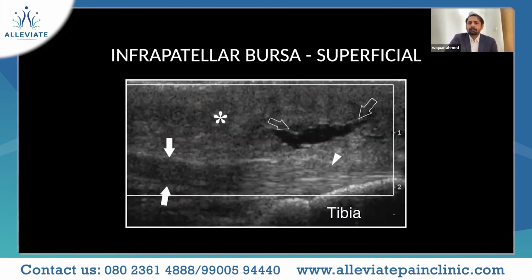Again, bursas, the infrapatellar bursa can be present, which is superficial to the patellar tendon. Here you can see that the arrows actually are pointing towards your patellar tendon, and there is a bursa above that.